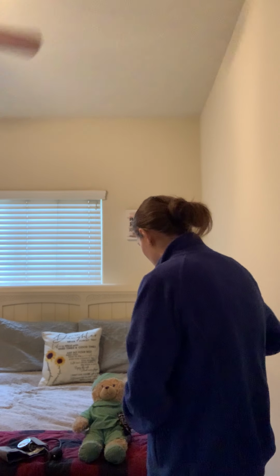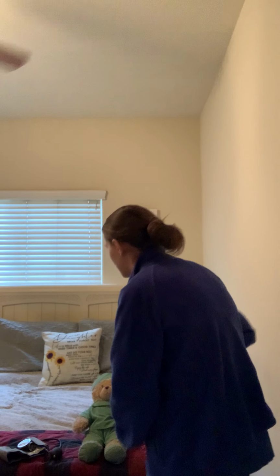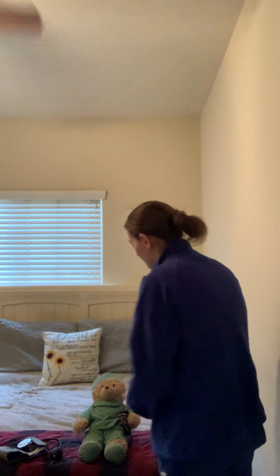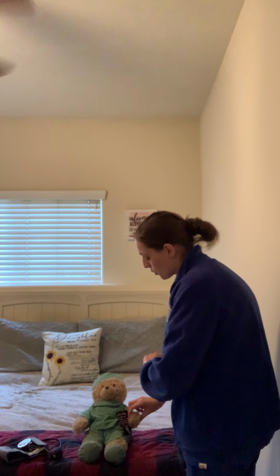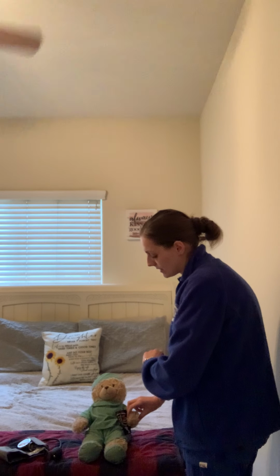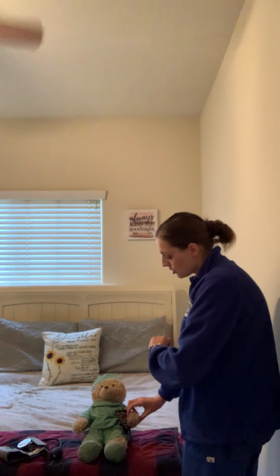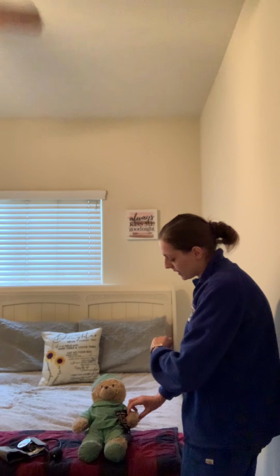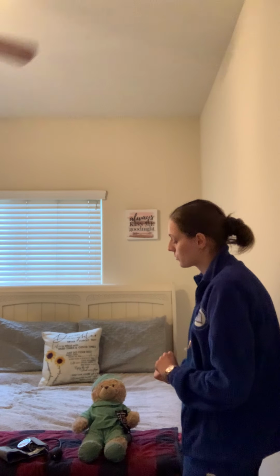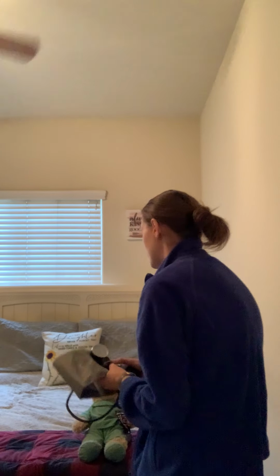So I'm going to go ahead and put this thermometer under your tongue, and we're going to wait for the beep. So 97.1, that's good. I'm going to go ahead and check my patient's radial pulse and just watch his respirations as well so that he doesn't know that I'm watching him breathe, so it doesn't alter my findings. So I do that for a full minute. I get 60 beats per minute and 20 for his respiration. So that's good. I can go ahead and do his blood pressure.